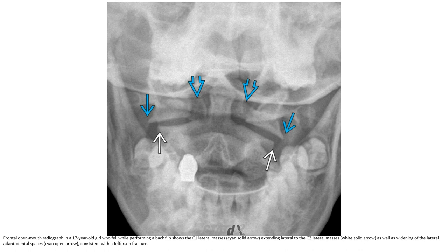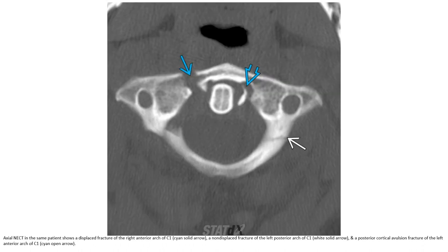This is a frontal open-mouth radiograph in a 17-year-old girl who fell while performing a backflip, showing the C1 lateral mass extending lateral to the C2 lateral mass, as well as widening of the lateral atlanto-dental space, consistent with Jefferson's fracture. Non-contrast CT in the same patient shows a displaced fracture of the right anterior arch of C1, a non-displaced fracture of the left posterior arch of C1, and a posterior cortical avulsion fracture of the left anterior arch of C1.